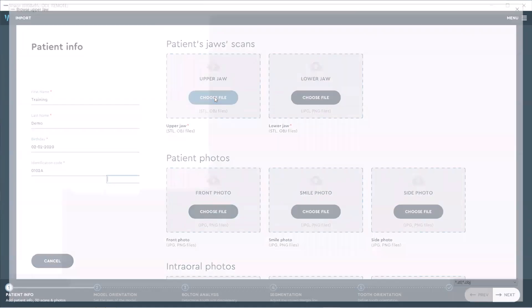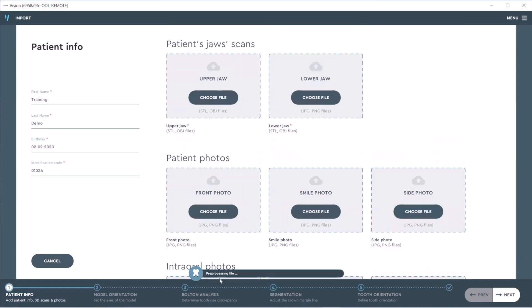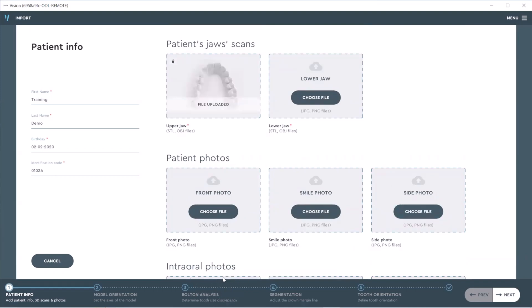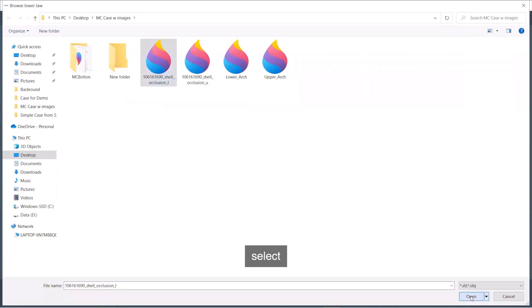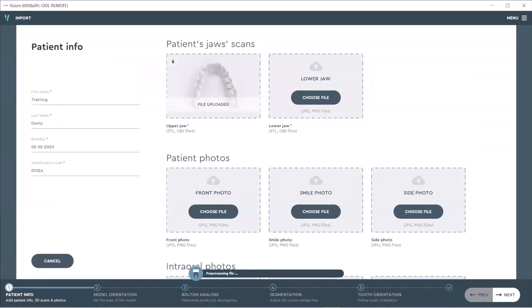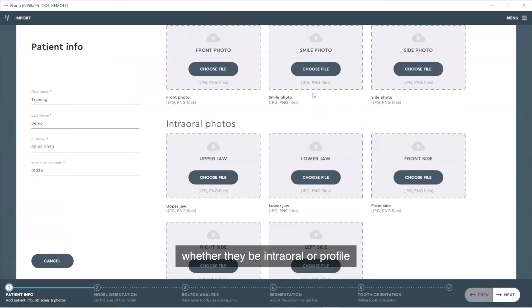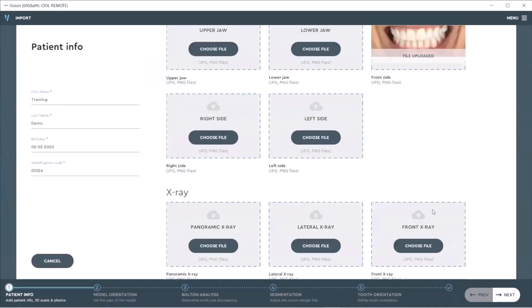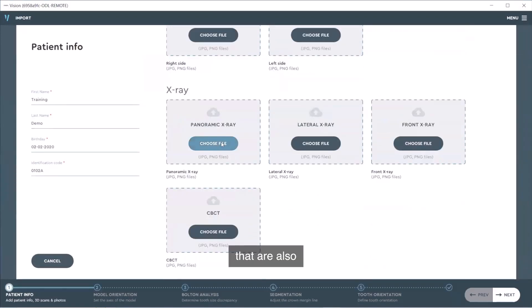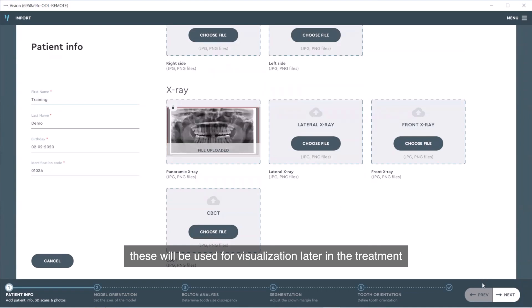We'll select our upper jaw. You'll browse for your file, select your STL or OBJ files, and click open. The timeline will tell you as soon as the case has been uploaded. Then we will choose our lower jaw — same process: select, click open. Any images you desire to upload, whether intraoral, profile, or panoramic x-ray images, are also an option. These will be used for visualization later in the treatment.